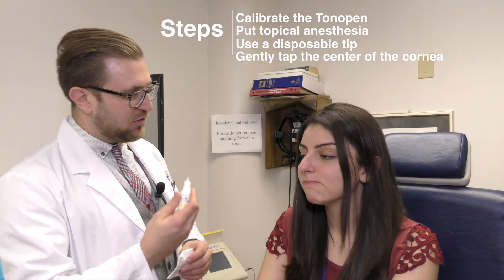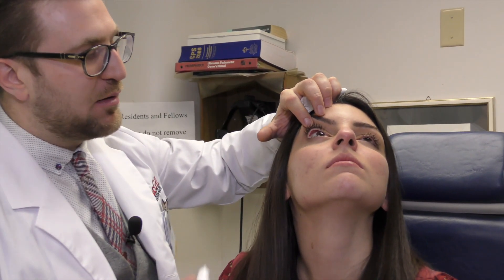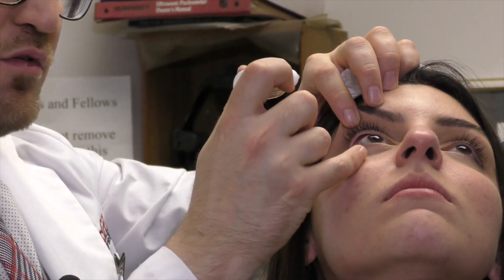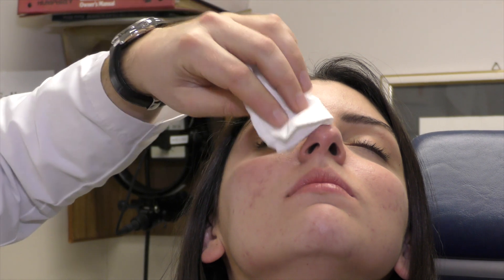You have to put in a topical anesthetic drop to numb the cornea, because you'll be gently indenting the cornea with the tonopen tip. I begin by giving the drop: I turn the patient's face, ask them to look up, and use my technique of instilling topical drops. With one hand I hold the upper eyelid for good exposure, and use my pinky to hold the lower eyelid down. I place one or two drops right in the lateral canthal inferior fornix area, so the drop pools there, gets absorbed into the eye, and works at its best efficiency.